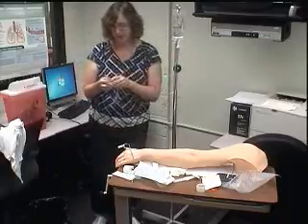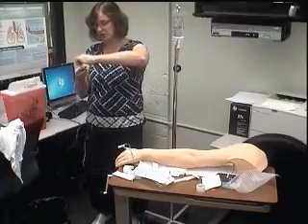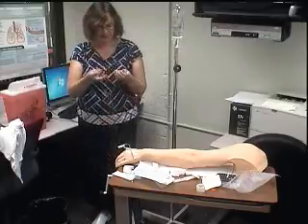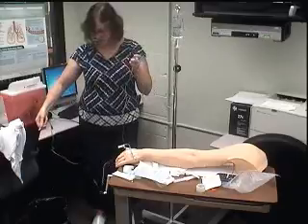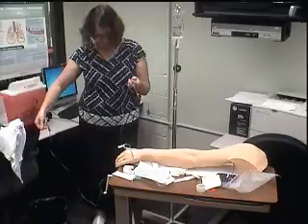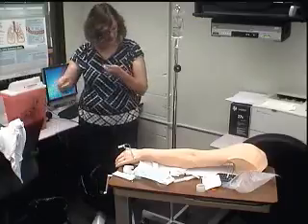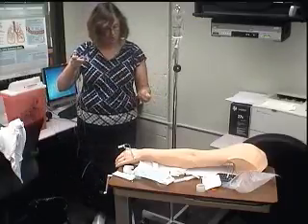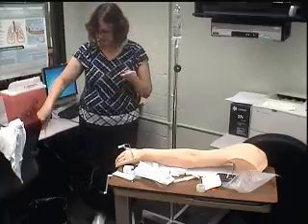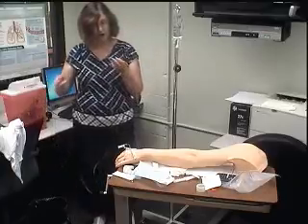So then once I've got it primed, this chamber filled halfway, then I'm going to loosen this up a little bit. Again, I never take it completely off. Some people do, and that's okay, but just make sure if you take it completely off that you don't contaminate it. Just like I did over here, I keep it above waist, and then I just hold it and fill it until the fluid comes out, getting all those little air bubbles out at the very end. It helps sometimes if you tilt this down while it goes through these little areas so that the air comes out of this little area too. All right, so once it's all primed, it's ready to go, turn it off.